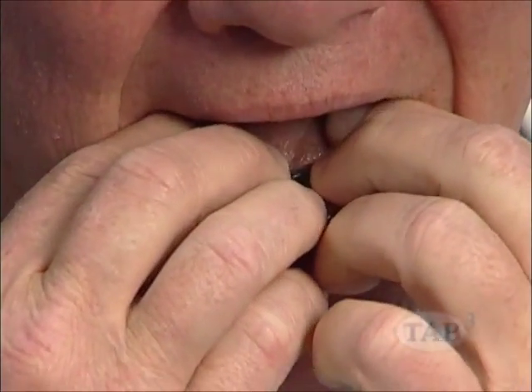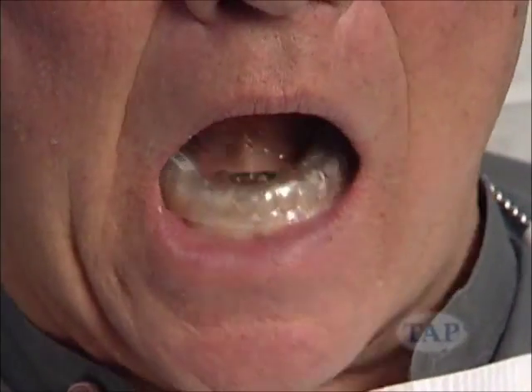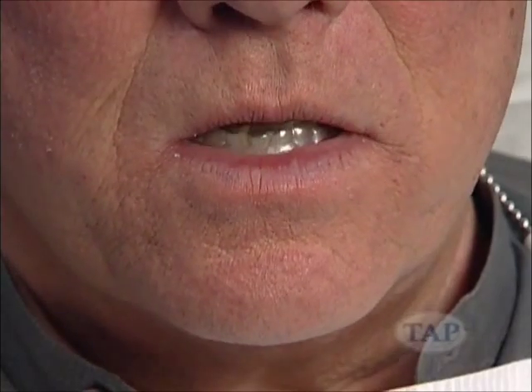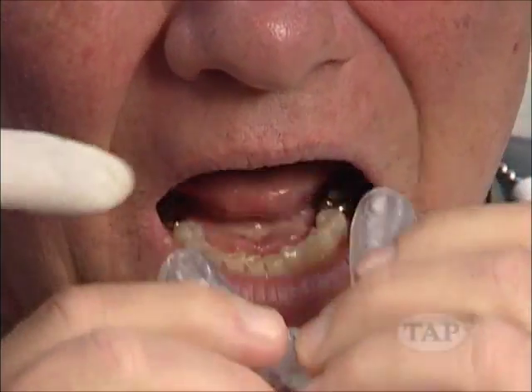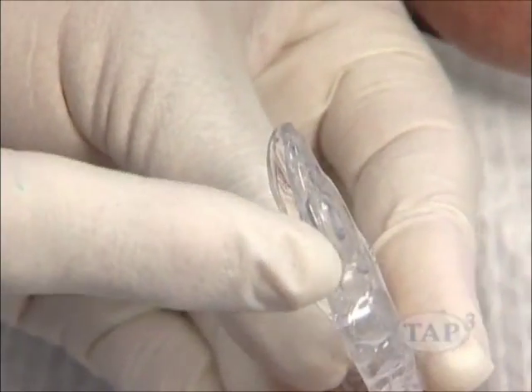Have the patient place the lower tray in their mouth. Check for fit, comfort, and retention. To remove the tray, have the patient push up on the posterior of one side of the tray with their thumbs. In this instance, on the lower tray, the appliance is too tight on the right buccal.